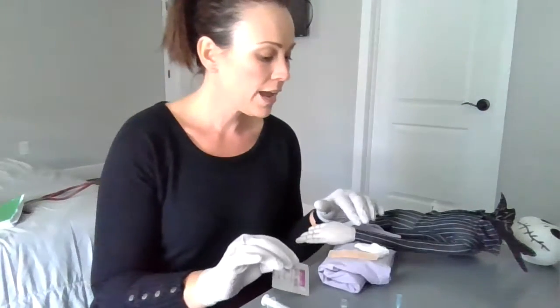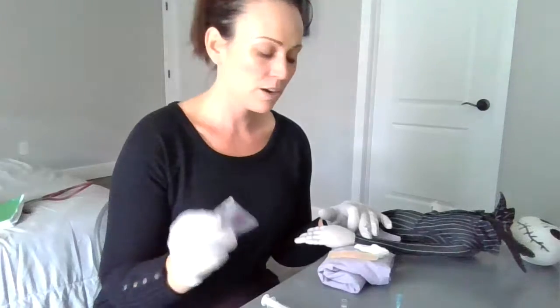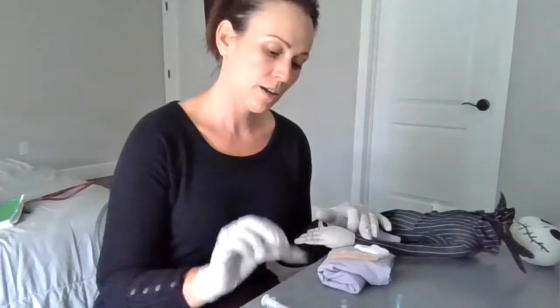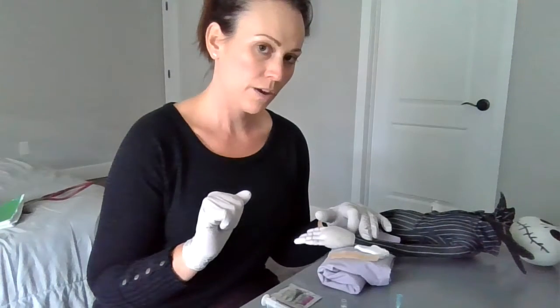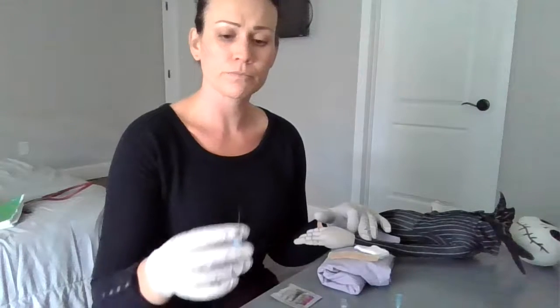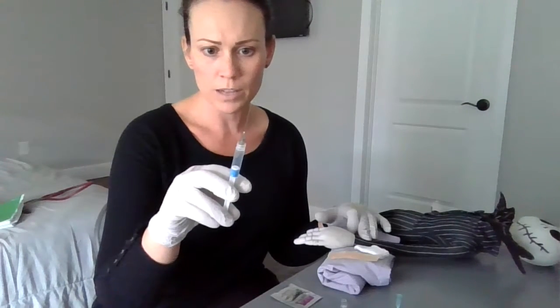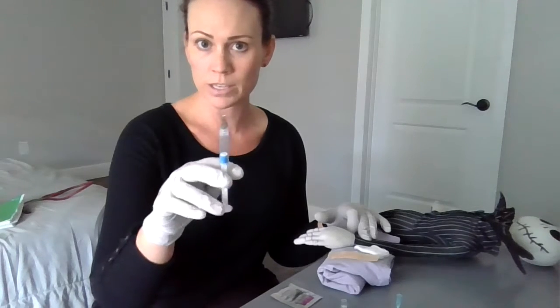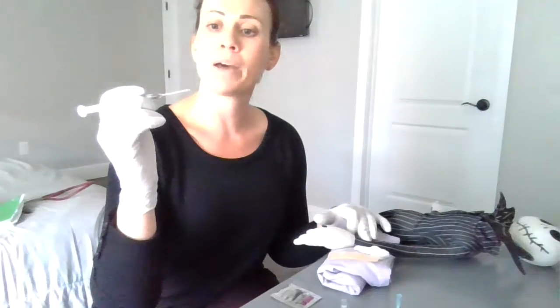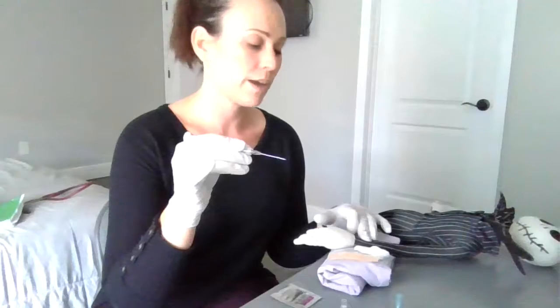So I'll go ahead and palpate for the radial artery. I have it here. I'm going to clean the area with the alcohol, make sure the alcohol dries before I insert the needle. I'm going to take the cap off the needle, pull back the syringe to 1.5 milliliters. We at least need 0.5 milliliters to have a good and accurate blood draw, so just keep that in mind. I'm going to make sure that my bevel is facing upward. I'm going to hold the needle like a pencil.